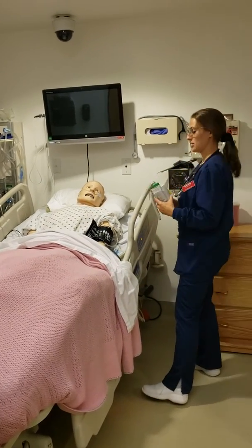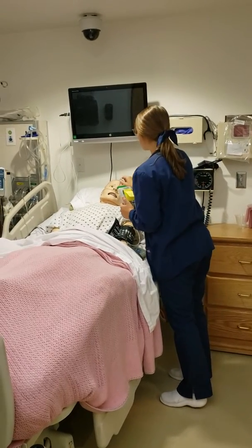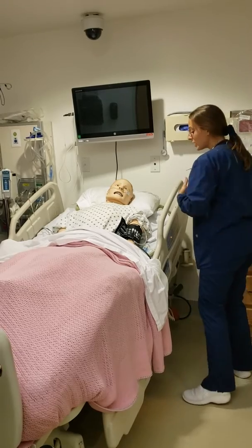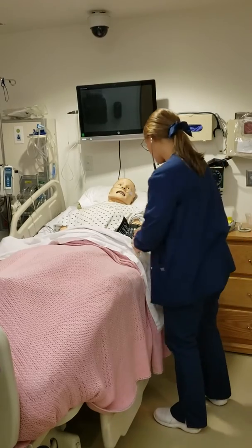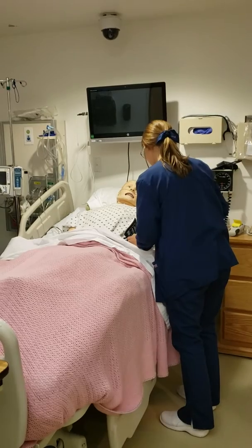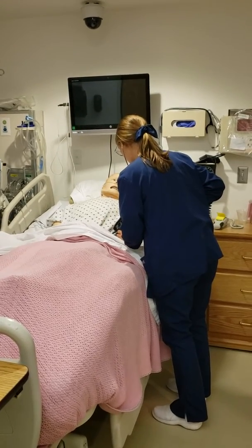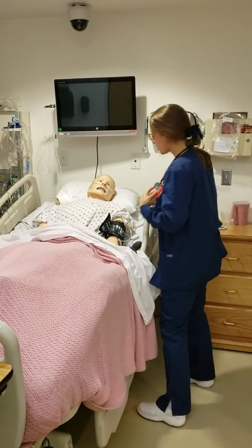So first, I'm going to take the oral temperature. I will put a plastic applicator on and place it sublingually under their tongue. Perfect, 98.7. I'm going to take your blood pressure really quick using the correct size cuff. Perfect, 120/80.